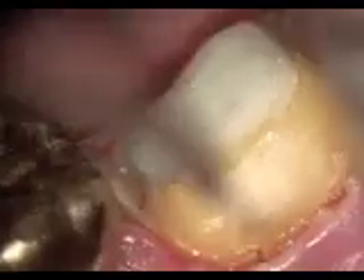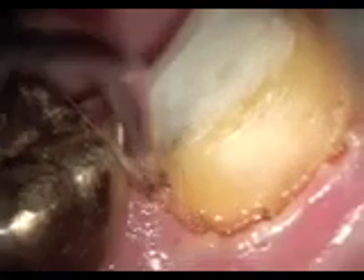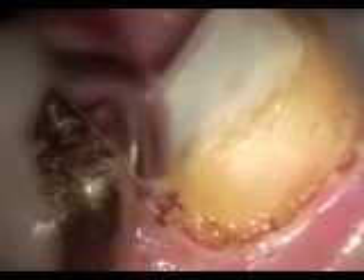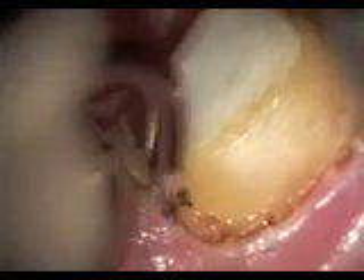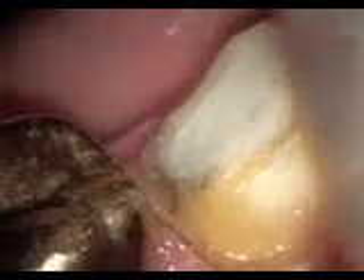This is videotaped through the operating microscope. You can see the mesial aspect of the tooth now. As the coagulant builds up on the tip you should remove it — probably should have removed a little bit more of the tip here. We're just creating this trough, and you can use Exocyl or Traxodent afterwards to try and laterally distend the tissue.